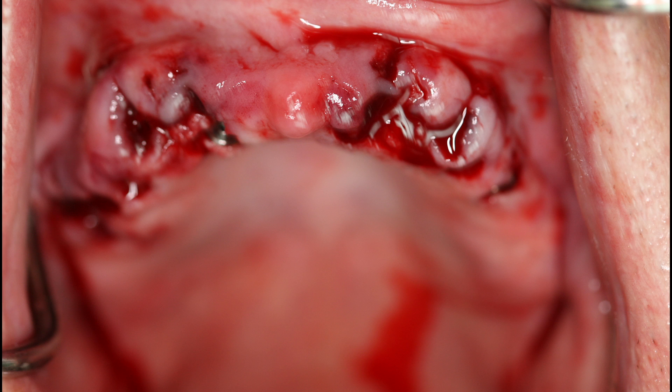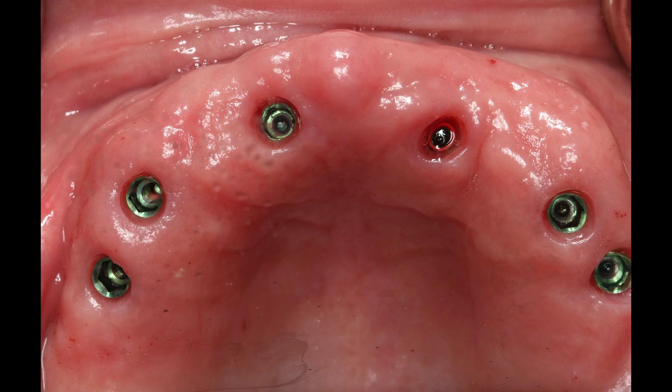Remember, we extracted teeth and placed our implants. After four months of healing and implant integration, the patient returned so a preliminary impression could be taken. Figure 8 demonstrates the removal of the healing abutments, which show healthy tissue surrounding the implant sites.